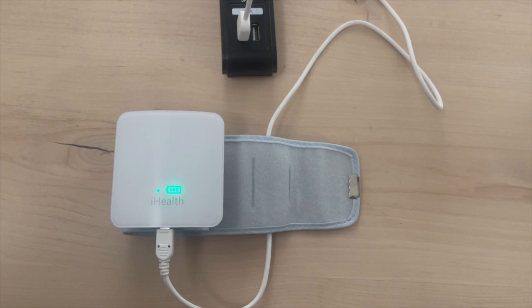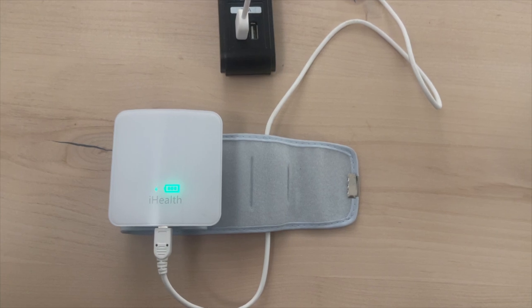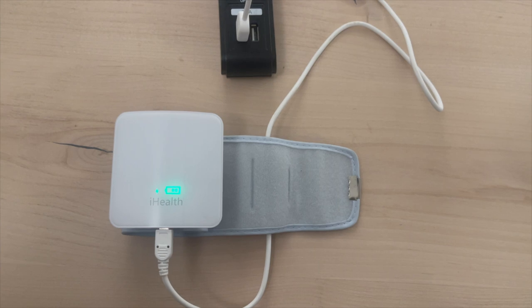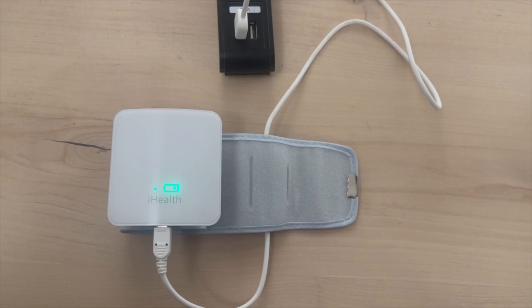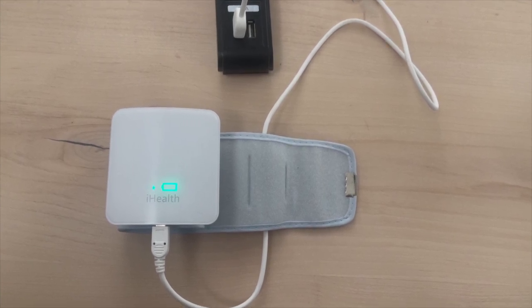user guides. After unboxing, charge the device by sticking the small end of the USB cord into the bottom of the blood pressure monitor, and the other end into a computer or wall charging outlet. The display will indicate that the battery is charging, and once the device is fully charged, which is indicated by a full battery symbol on the device, you're ready to pair your device.